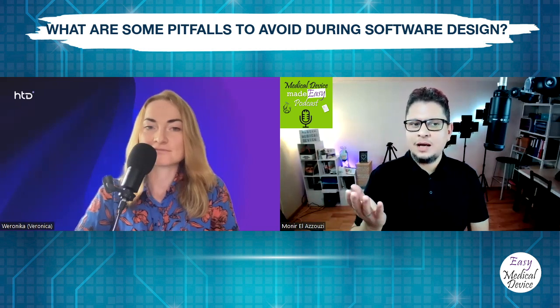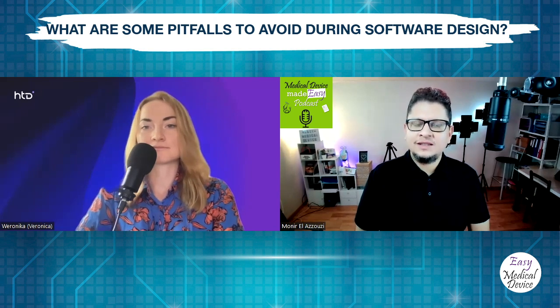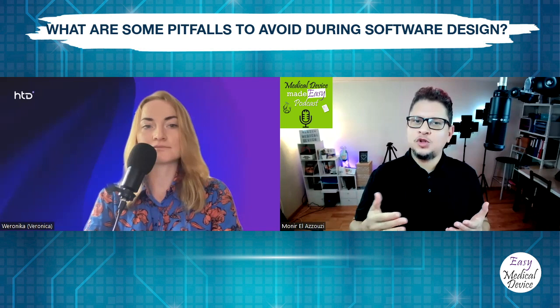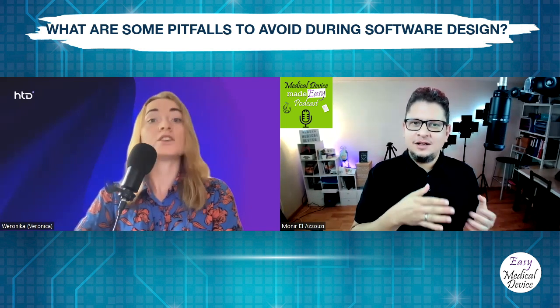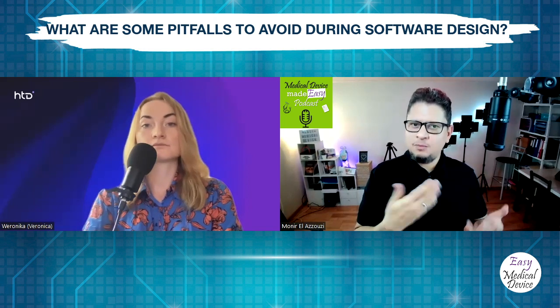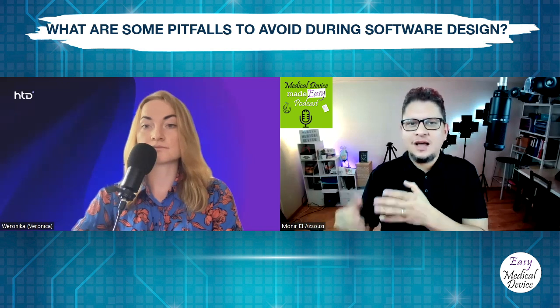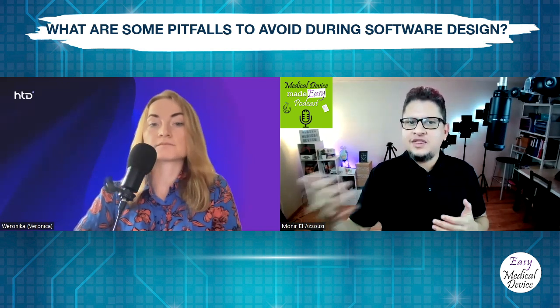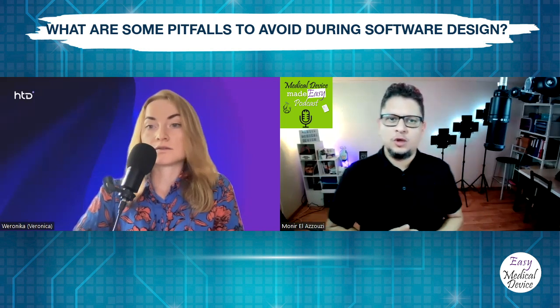And if we now compare to what we said before about risk management, this standard is also asking you to do some iterative usability, like a formative study during the development of the device or the software, and then a summative study at the end to confirm that everything is fine. So it's the same. Don't wait until the end to verify that everything is fine. Work in advance and do some formative evaluation of your software.